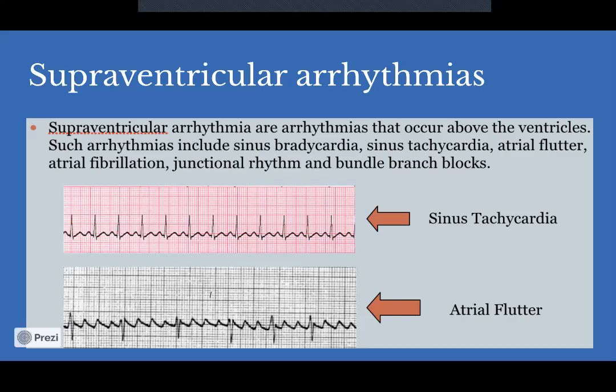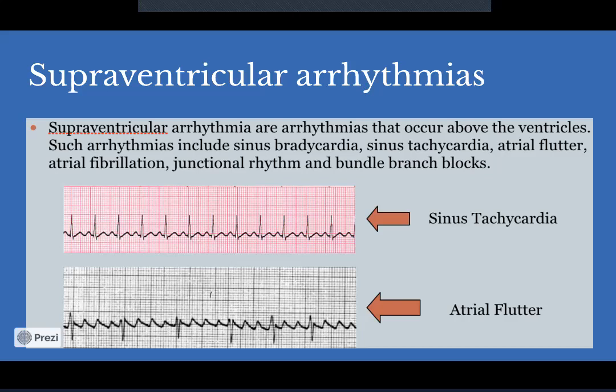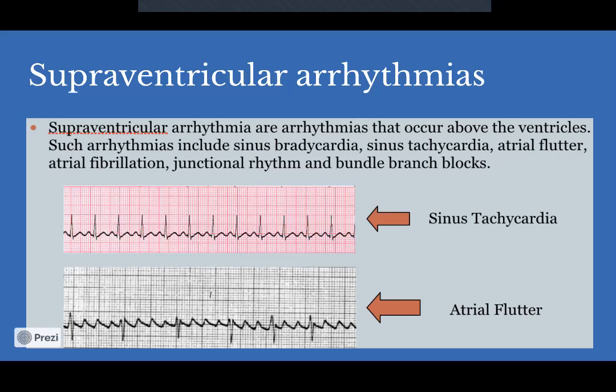And so I'm going to count the P wave. So 1, 2, 3, 4, 5, 6, 7, 8. I meant R waves, by the way. Sorry. 1, 2, 3, 4, 5, 6, 7, 8. I think I said 8 times 15.